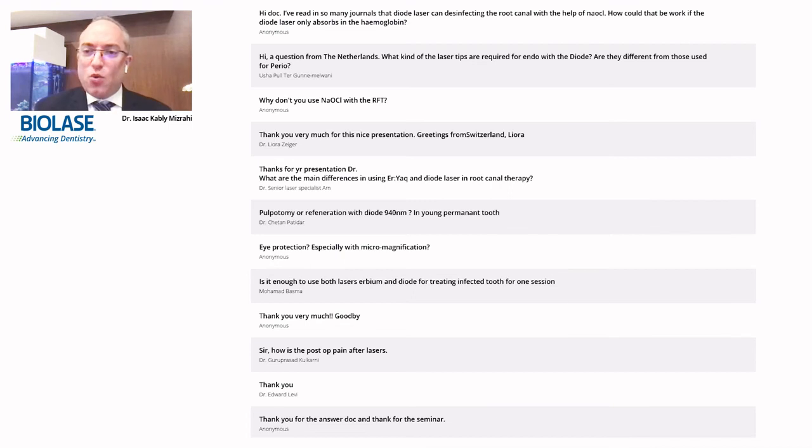Okay, the question about what kind of laser tips are required for endo with the diode, and that they're different from those used in perio. On the 940 nanometer laser, on the EPIC laser, you can use the E2, as I stated in my presentation, and it is 200 microns. It's like a 20 to 22 instrument inside. So you can go there and try to touch those walls at 1 watt continuous wave with circular movements at 2 millimeters per second for each canal. And there are techniques that you can read in the literature on the way to do it.